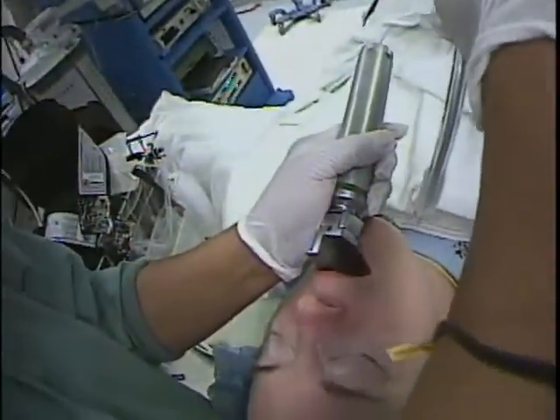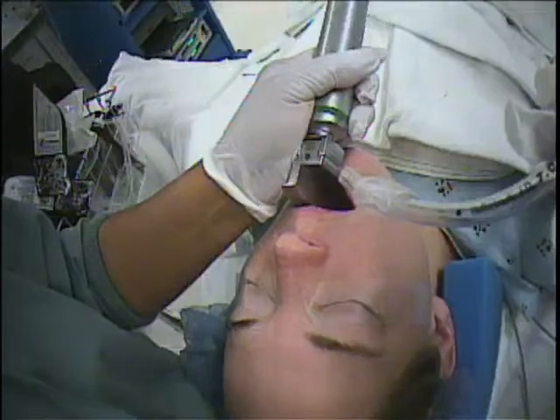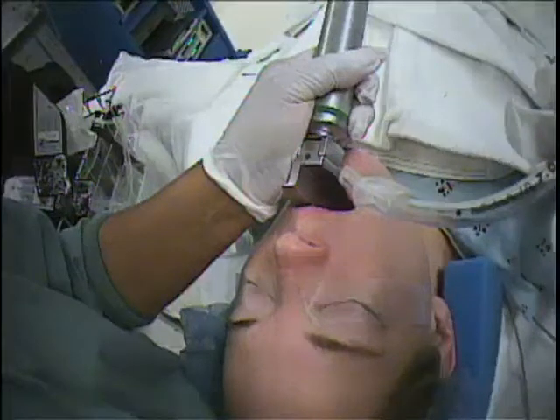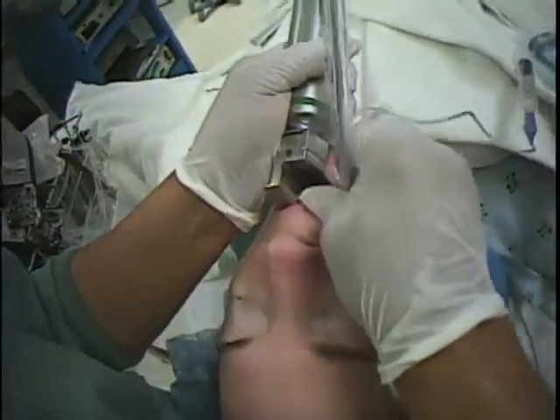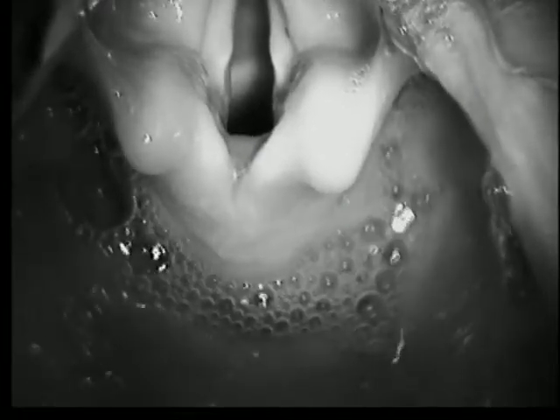Pick up the tube with your right hand. You can also ask your assistant to hand it to you in the correct orientation for insertion. You should keep your eyes on the trachea. Hold the pre-selected tube in your right hand like a pencil, curve forward. Pass the tube to the right of the blade, into the larynx through the cords. If the patient is breathing, time the thrust for inspiration when the cords are most open. Watch the tube pass through the cords if you can.